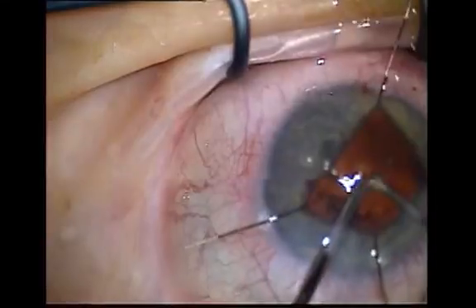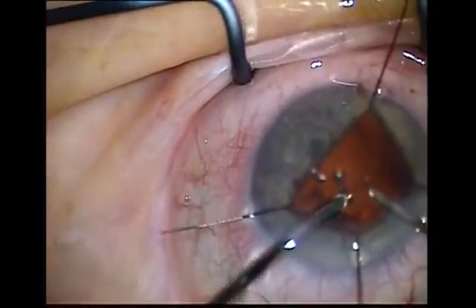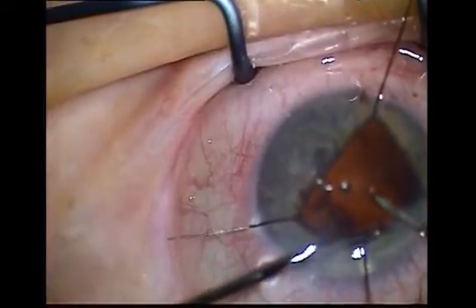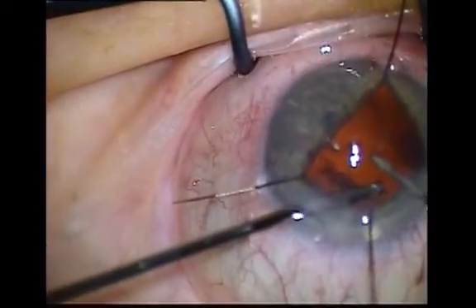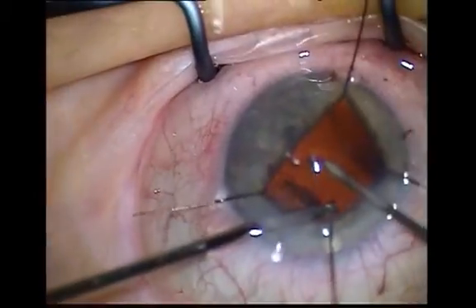Push the vitrector into the capsule rent, into the anterior vitreous, and draw vitreous back from the anterior segment into the posterior segment.